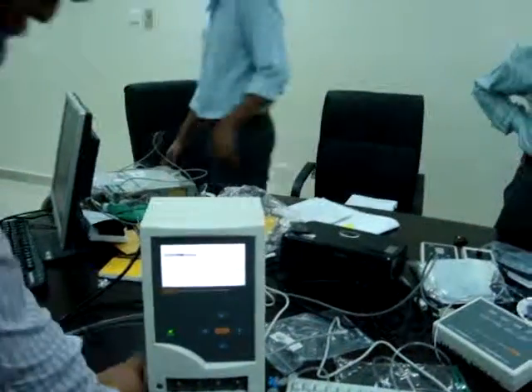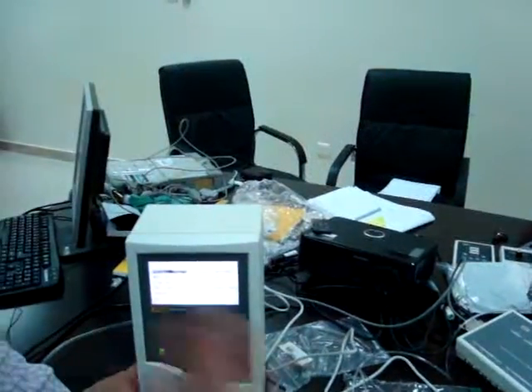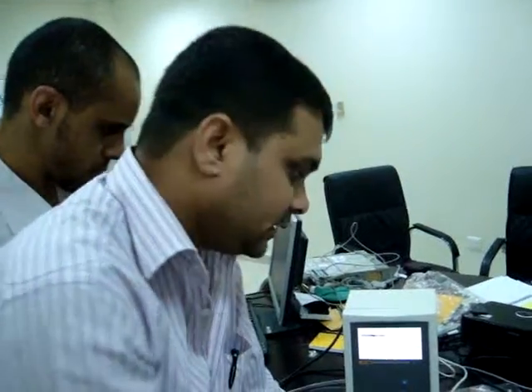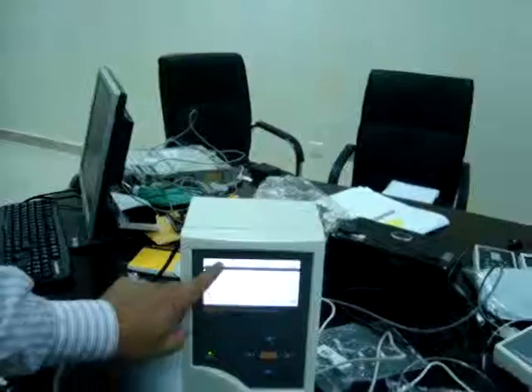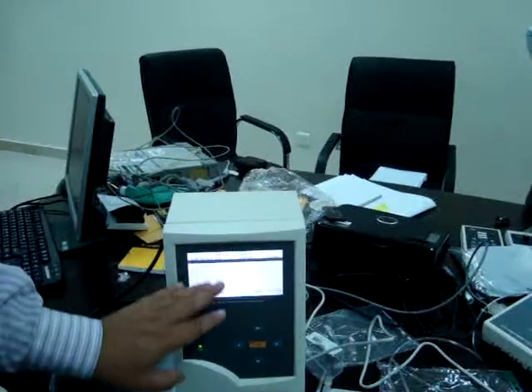Yes. So under utilities, you have options as you do routine testing. See, I have 3 types of infusion pumps and 2 types of syringe pumps in my hospital. So what test I do, I know. I can program it, and after I do the test I can just recall and use it. Now we have not done any test, so this is empty.